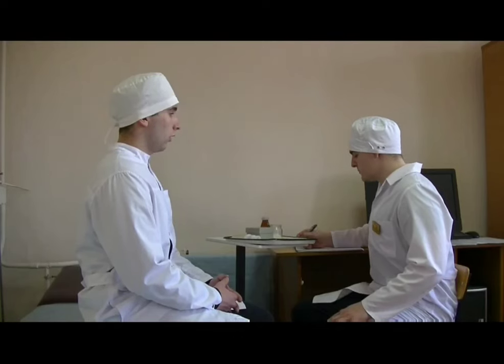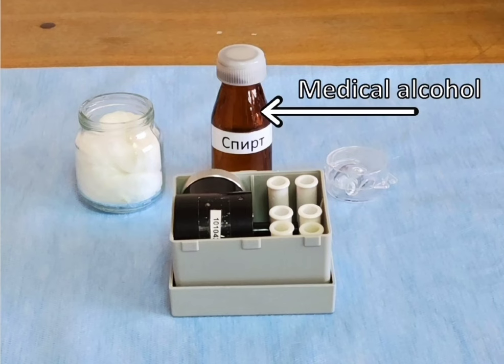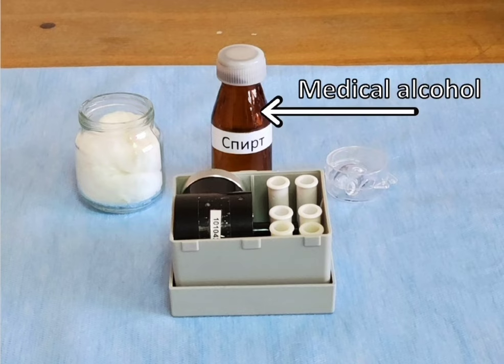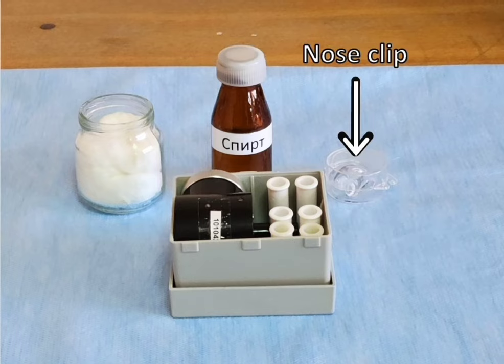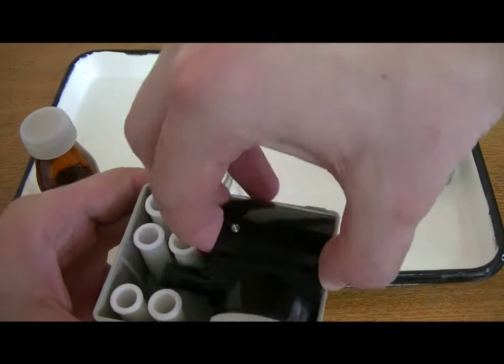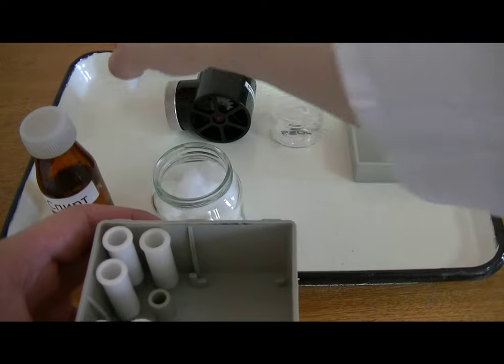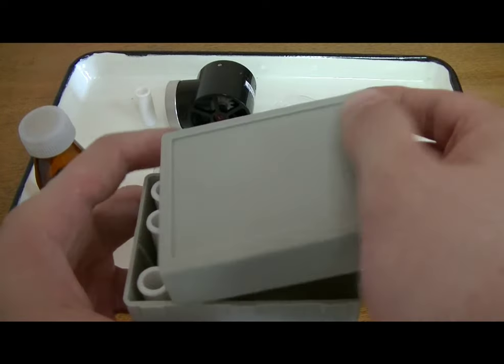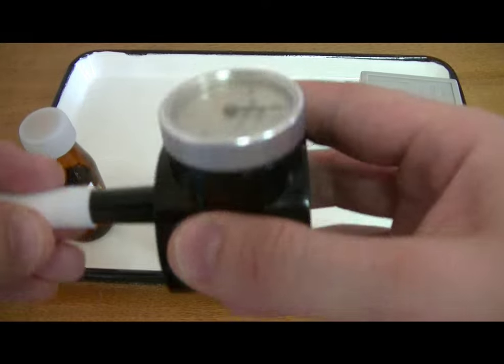Begin by informing the patient about conducting the measurement. Collect the patient's information: first name, last name, age, and height. For this method you will need medical alcohol, cotton wool, a spirometer, and a nose clip.